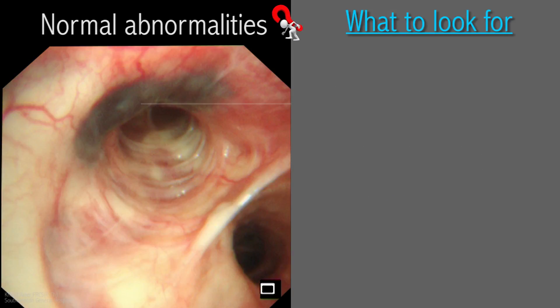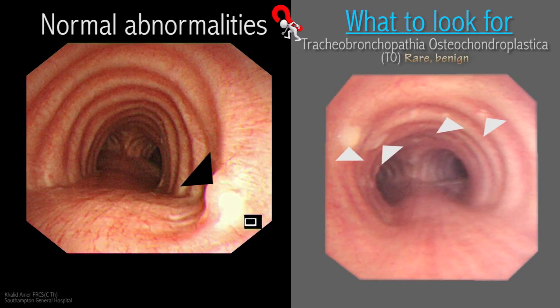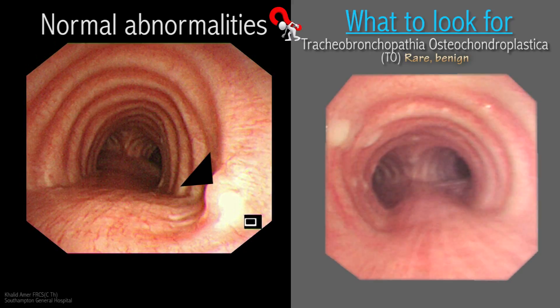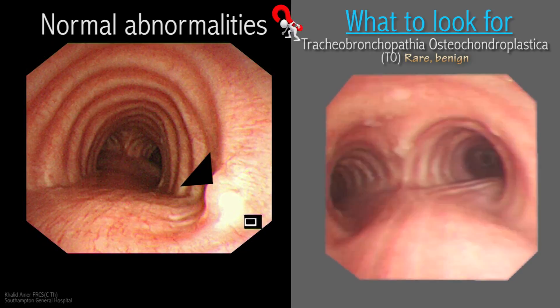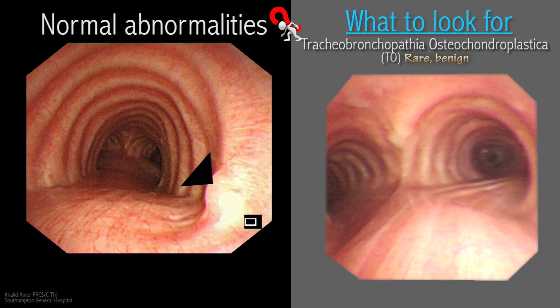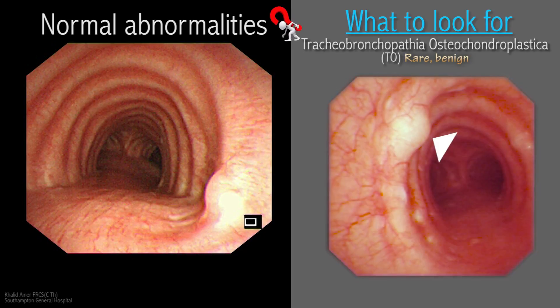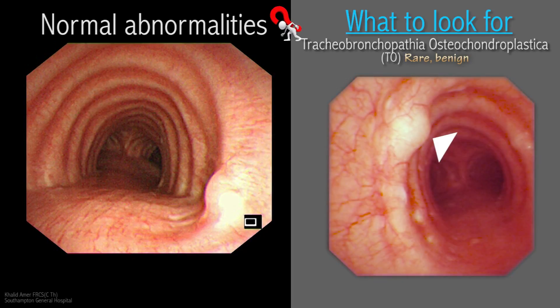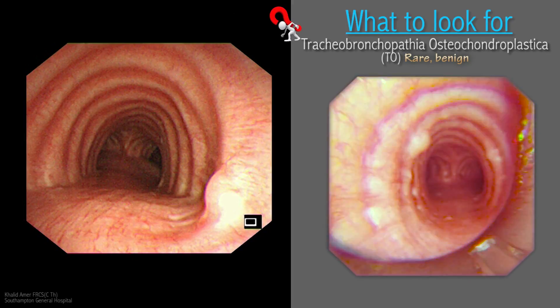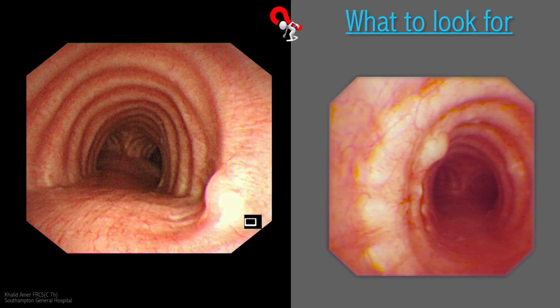One of the normal abnormalities that the operator should be aware of is the condition known as tracheobronchopathia osteochondroplastica, or TO for short. These are benign submucosal ecchondromas seen at the cartilaginous rings — never on the membranous part — and can be obstructive, sometimes associated with recurrent chest infections and haemoptysis.